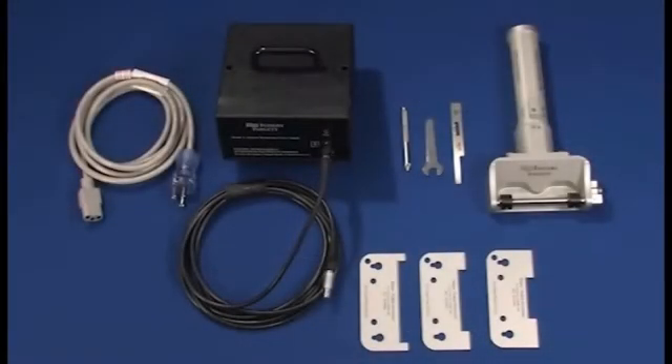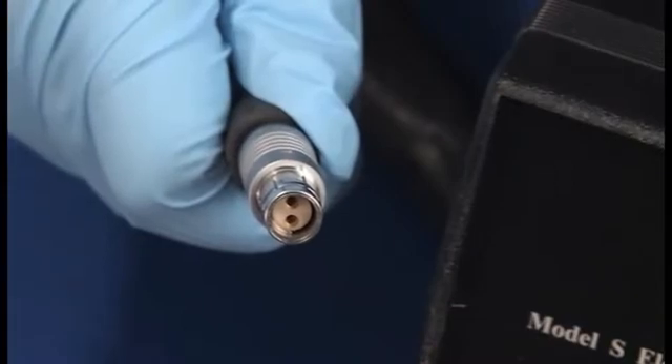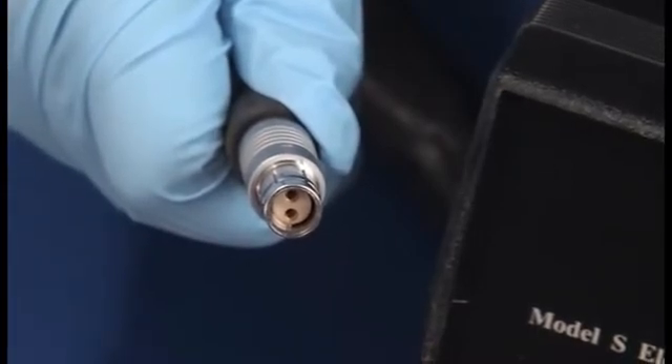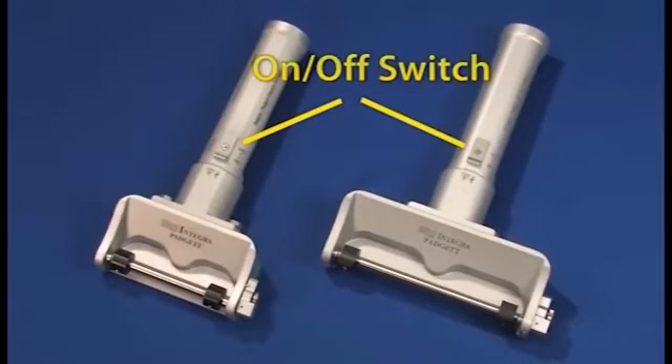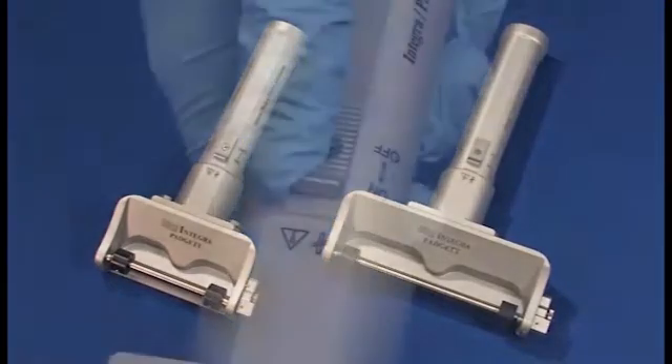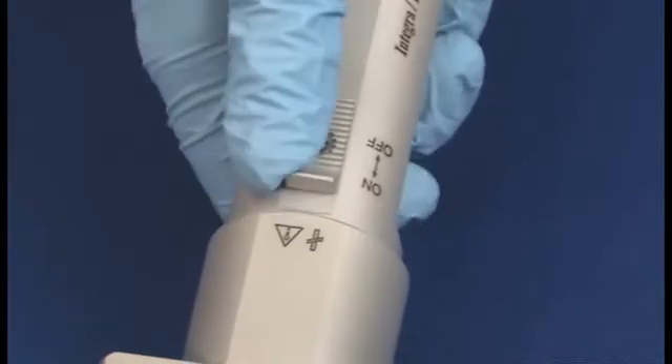The Model S electric dermatome features a 48-volt DC power supply. The power cord is removable and should be inserted straight into the dermatome and power supply according to their respective markings. The Model S and S6 dermatome on/off switch is located here and operated with the surgeon's thumb. Push the switch forward to turn the unit on, and slide the switch back to turn the unit off.